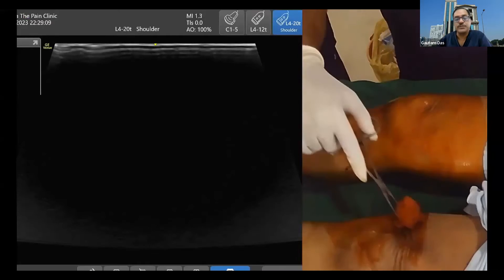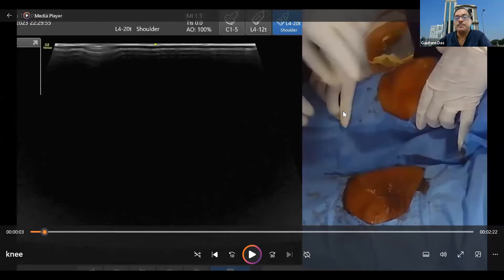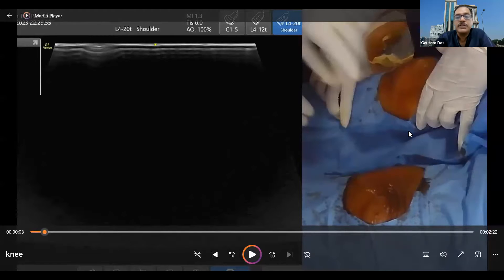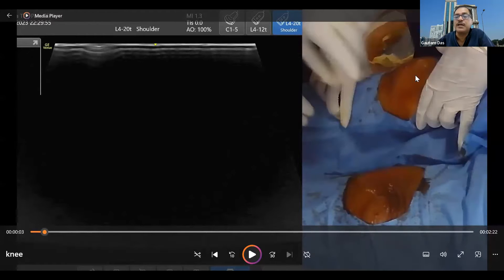First, look at the patient position. What is the patient position? The knee is extended and a little bit externally rotated. When we are doing aspiration in the suprapatellar recess, the knee is around 30 to 45 degrees flexed. But here the knee is extended, with maybe a slight flexion around 5 degrees.